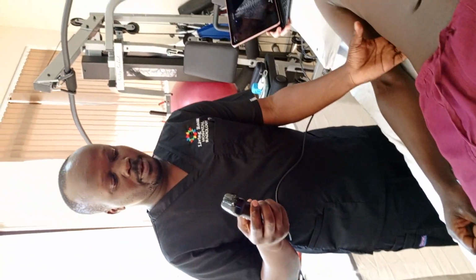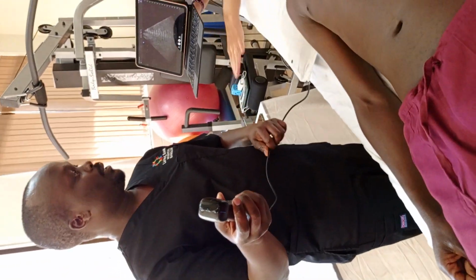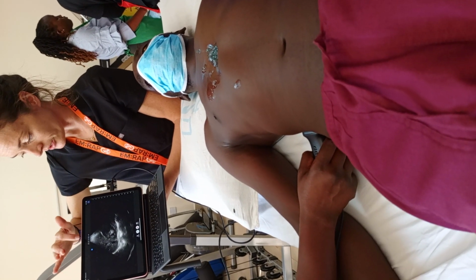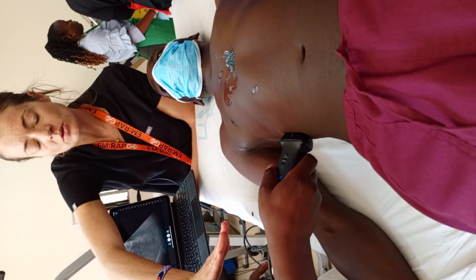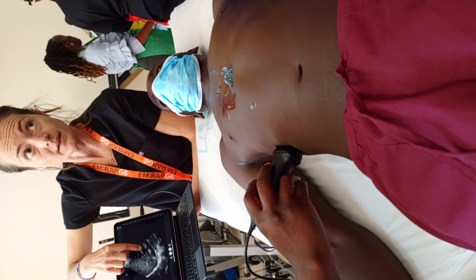Okay, we go for this place, the space between the liver and the right kidney. Go ahead. Normally, the hepatorenal space or Morrison's pouch. So, all right, so on here, we're seeing this is the liver, this is the kidney. So just to orient you, this part right here is right where the probe is touching the skin. So this is the most superficial. As the ultrasound waves go through his abdomen, you see that he's touching skin, and then you see liver, and the deeper you go, you see kidney, okay?